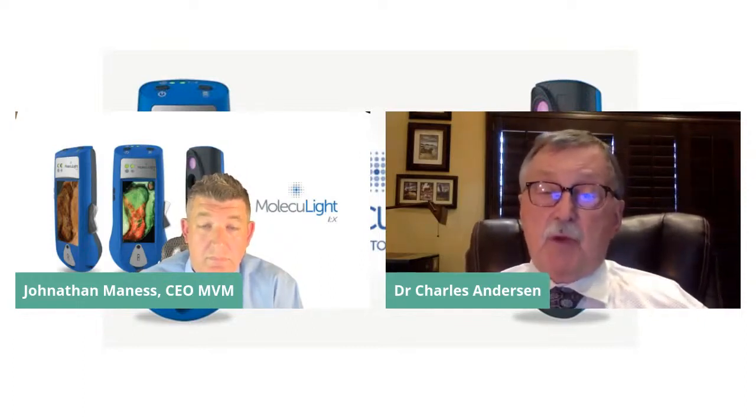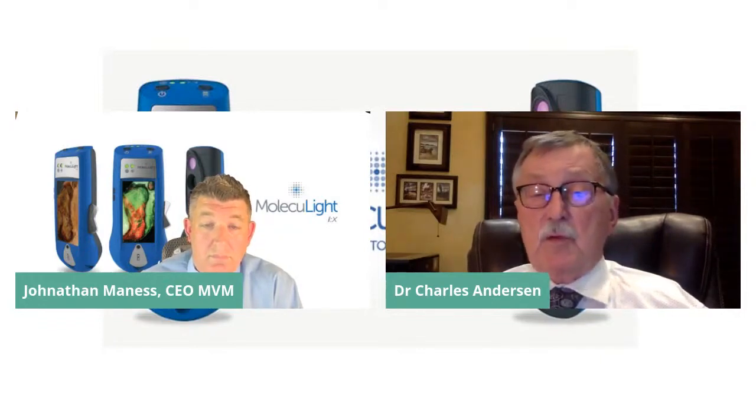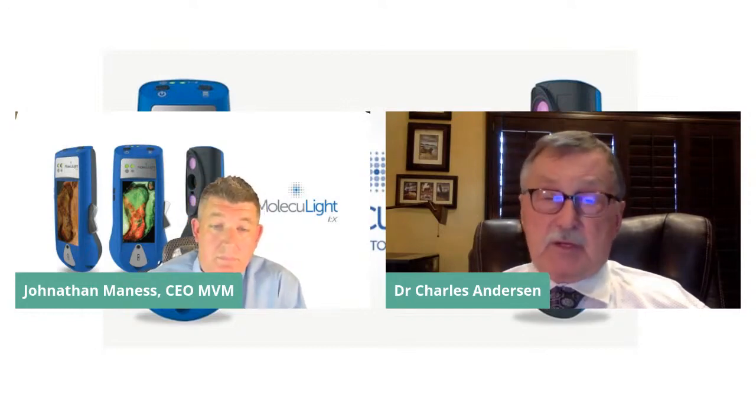Very much a team approach is critical, but the ability to determine whether or not there's bacteria in a wound is critical. So when you see a patient, for example, with a diabetic foot ulcer, there are two confounding factors that will take that patient with a diabetic foot ulcer to an amputation.